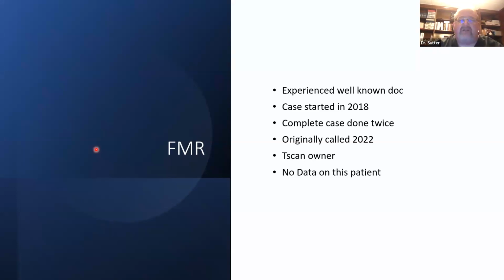In fact, the case started in 2018, and I was called 4 years later, and the full mouth rehab had been done twice. Okay, this person owns a T-scan, doesn't really use it, thinks that they can read the dots, which none of us can, the ink marks on teeth, and is really struggling. The patient's getting irritated.